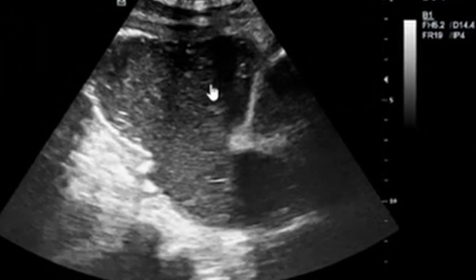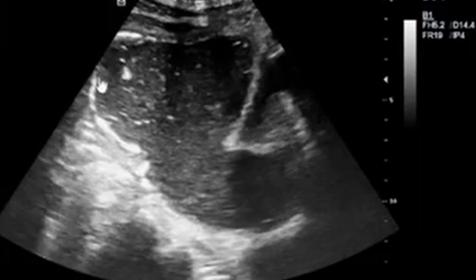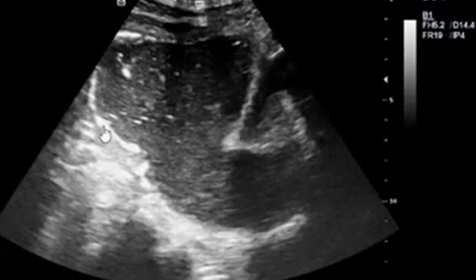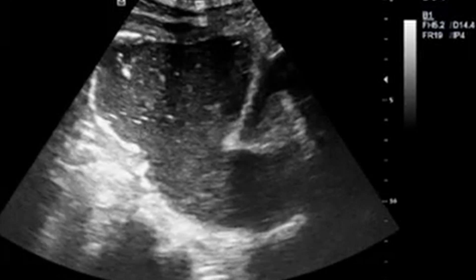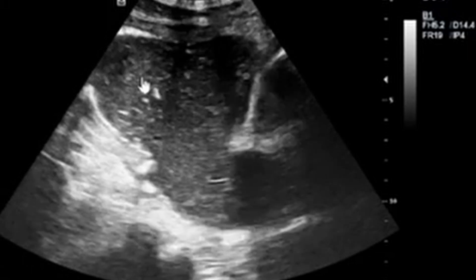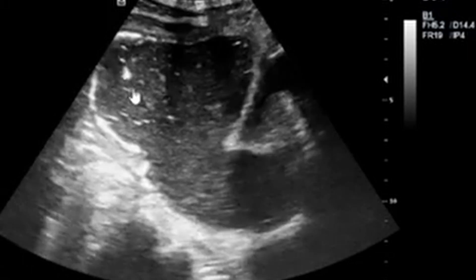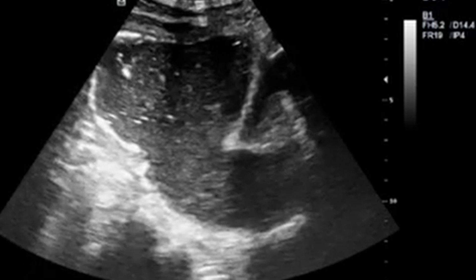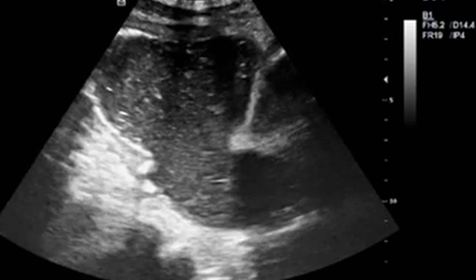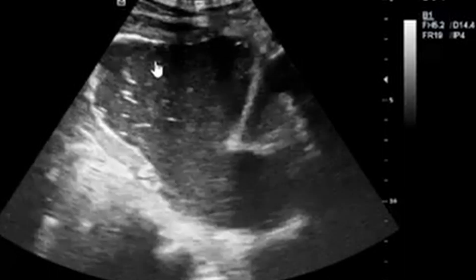You can appreciate what I'm talking about. This is the outline of our rectum. You can see the internal echoes — these are some particles of your fecal matter. You can actually see some movement taking place, indicating that the fecal matter is actually floating in free fluid.